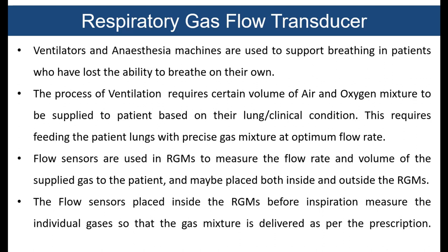The process of ventilation requires a certain volume of air and oxygen mix to be supplied to the patient based on their lung and clinical condition. This requires feeding the patient a precise gas mixture at optimum flow rate. Flow sensors are used in RGM, the respiratory gas flowmeters, to measure the flow rate and volume of the gas supplied to the patient, and may be placed both inside and outside of the respiratory gas flowmeters. The flow sensor placed inside the respiratory gas monitor before inspiration measures the individual gases so that the gas mixture is delivered as per the prescription.